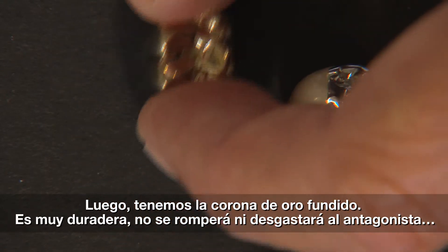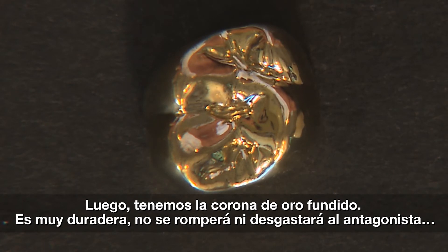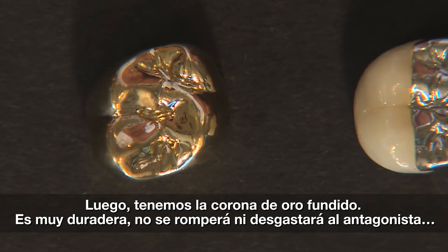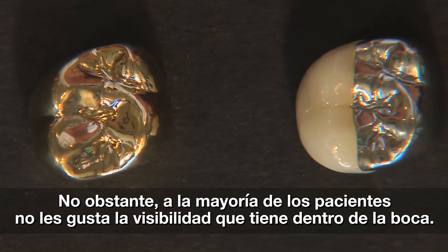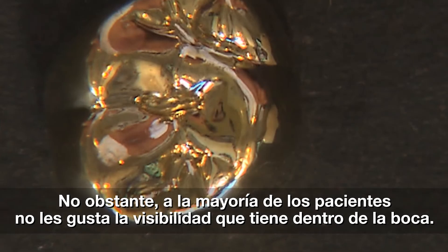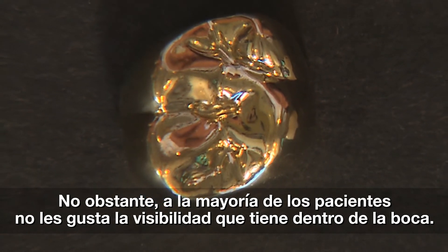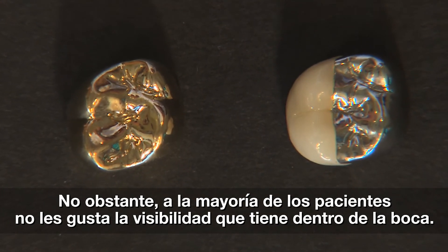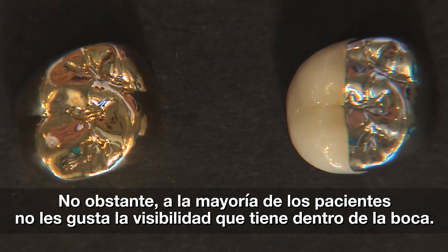Another solution is certainly to go with a cast gold crown, and there's really nothing bad you can say about it. Gold is the longest-lasting restoration I've ever seen in the mouth — it won't break, it wears well, it doesn't wear the opposing teeth. Everything you can say about it is really nice, except for the fact that depending on where it is in the mouth, it can be seen from about 30 feet away. There are just patients who simply refuse to have cast gold in their mouth. So we've got a situation where, because we had a short clinical crown — maybe a lower second molar — with limited interocclusal space, and we need to place a crown back there.